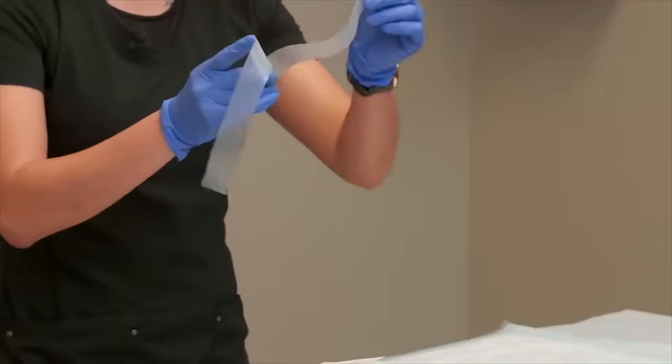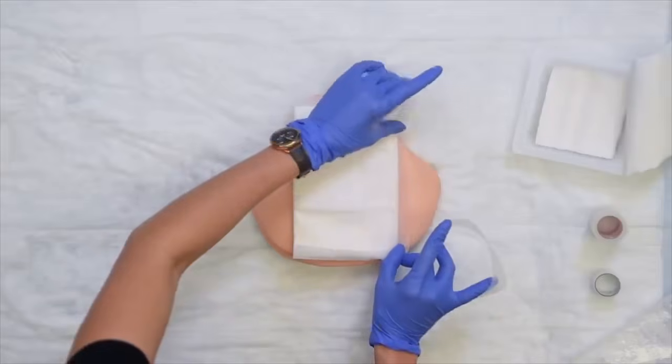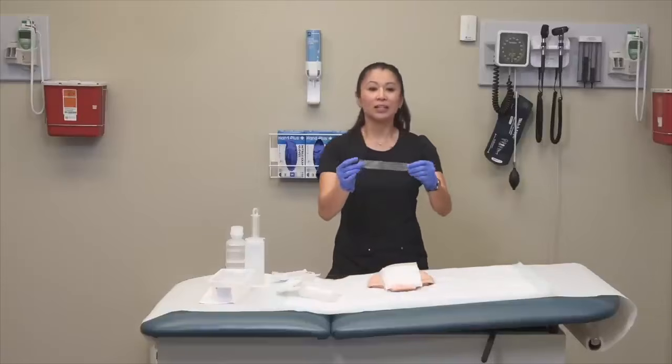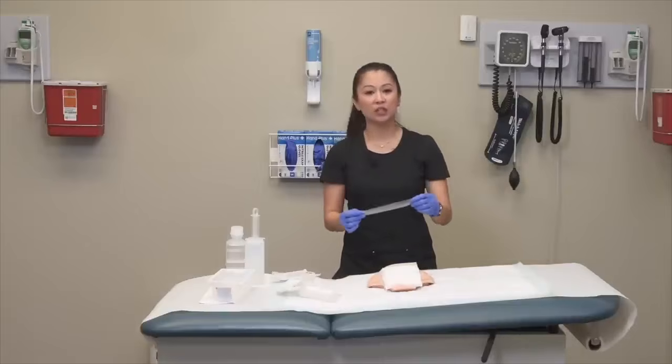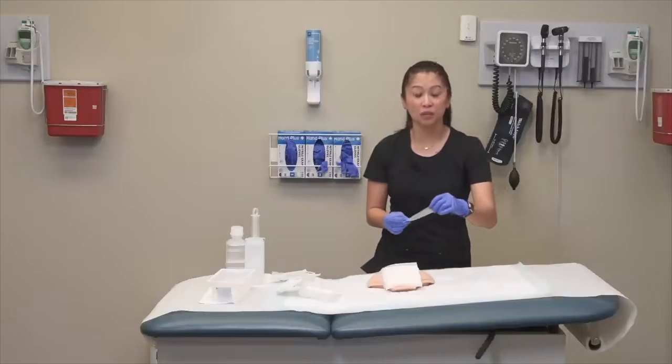Also just keep in mind that when you are taping this down, every patient has different allergies. So I'm using this plastic tape. If your patient has adhesive allergies, note that as well. There are different options we can use.